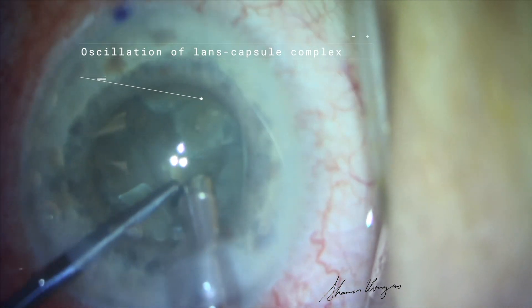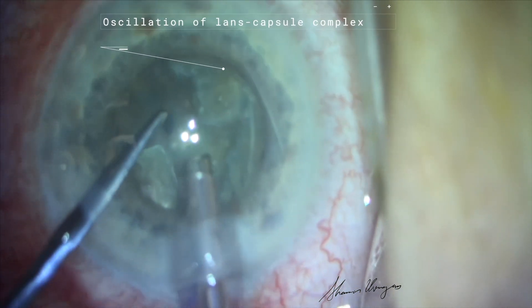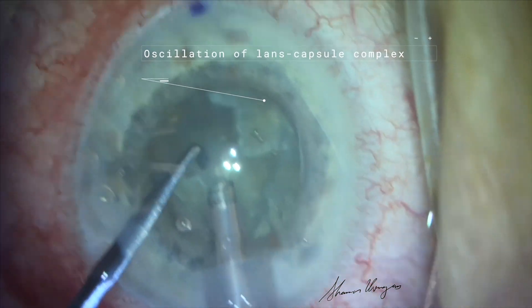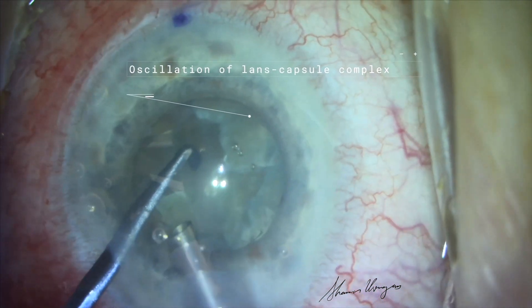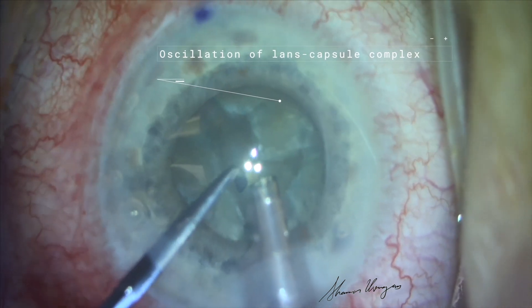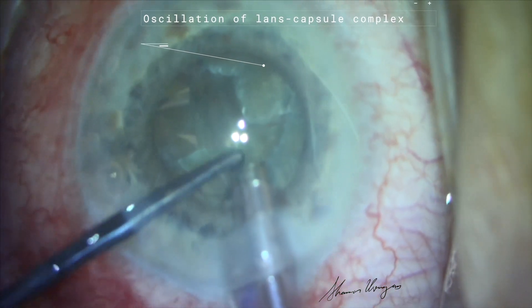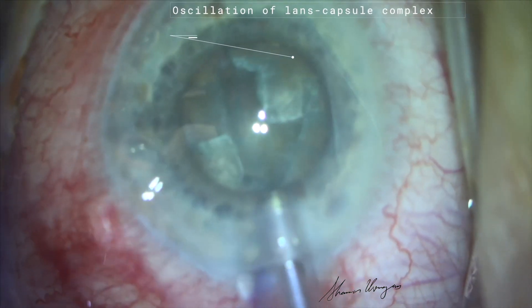We begin phacoemulsification and notice that the lens does not rotate easily. Additionally, at the 1 to 2 o'clock position, there is an anterior to posterior oscillation of the lens and capsule, which would indicate an area of zonular weakness.